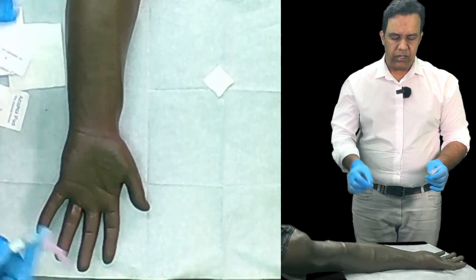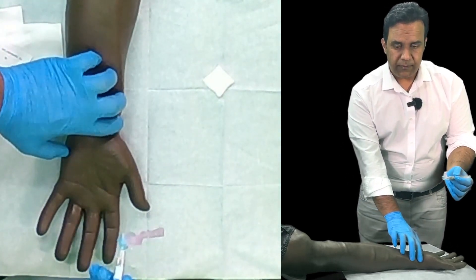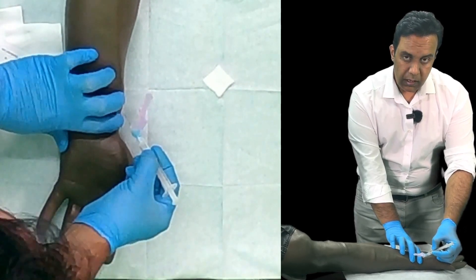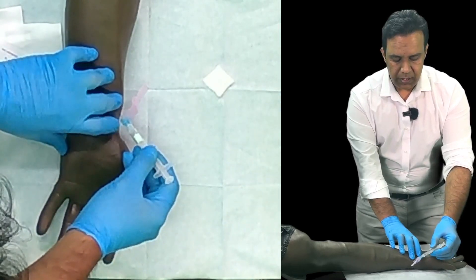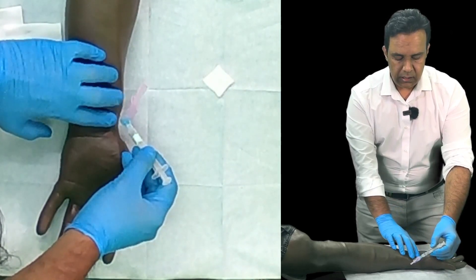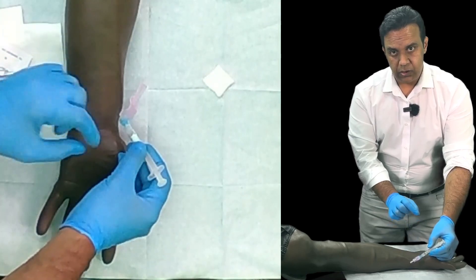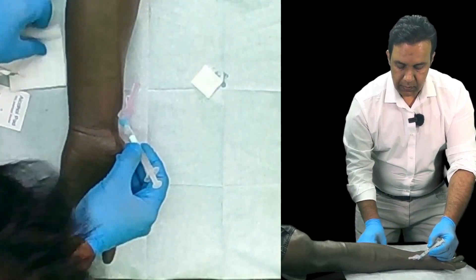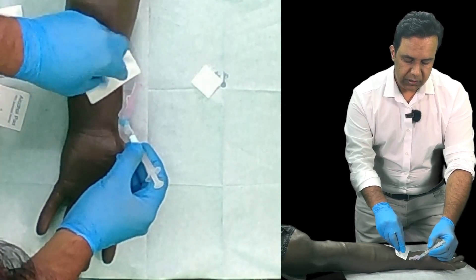Take your needle, hold it like a pen, and insert it. Warn the patient of a sharp scratch. You will see blood coming into the syringe — you do not need to push or pull. After the procedure is done, you are ready for the next step.